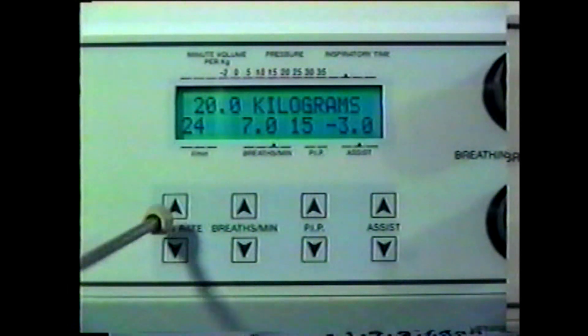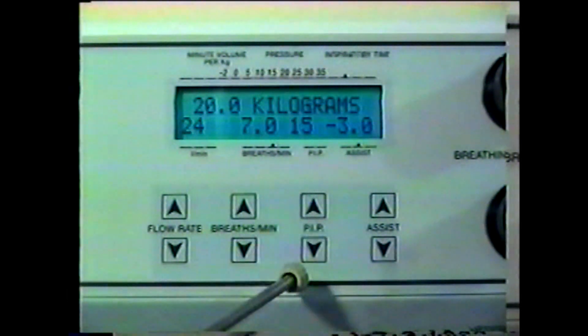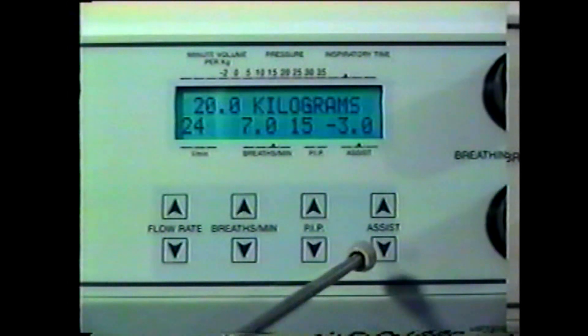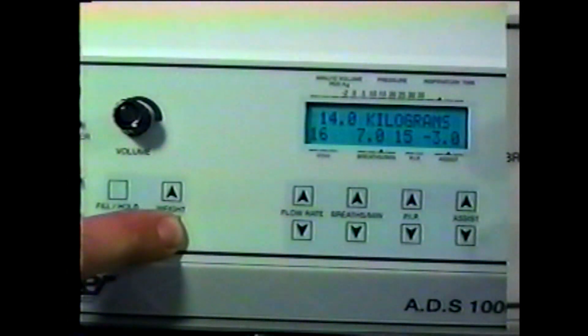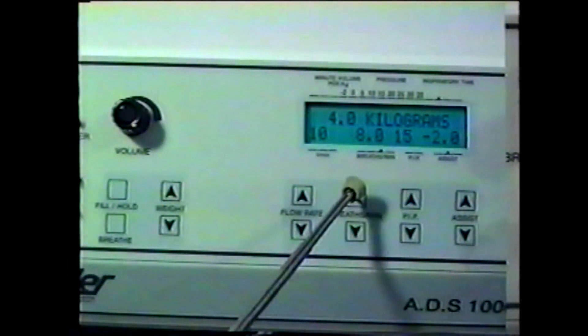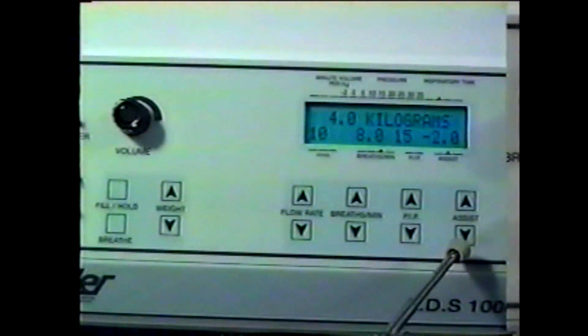Based on your patient's weight, the ADS will automatically adjust and display the flow rate, the breaths per minute, the peak inspiratory pressure measured in centimeters of water, and the amount of inspiratory effort required by the patient to initiate a breath. All of these parameters can be manually adjusted by the operator. For a 4-kilogram patient, the ADS adjusts to a flow rate of 10 liters, 8 breaths per minute, a peak inspiratory pressure of 15 centimeters of water, and an inspiratory effort of minus 2 centimeters of water.